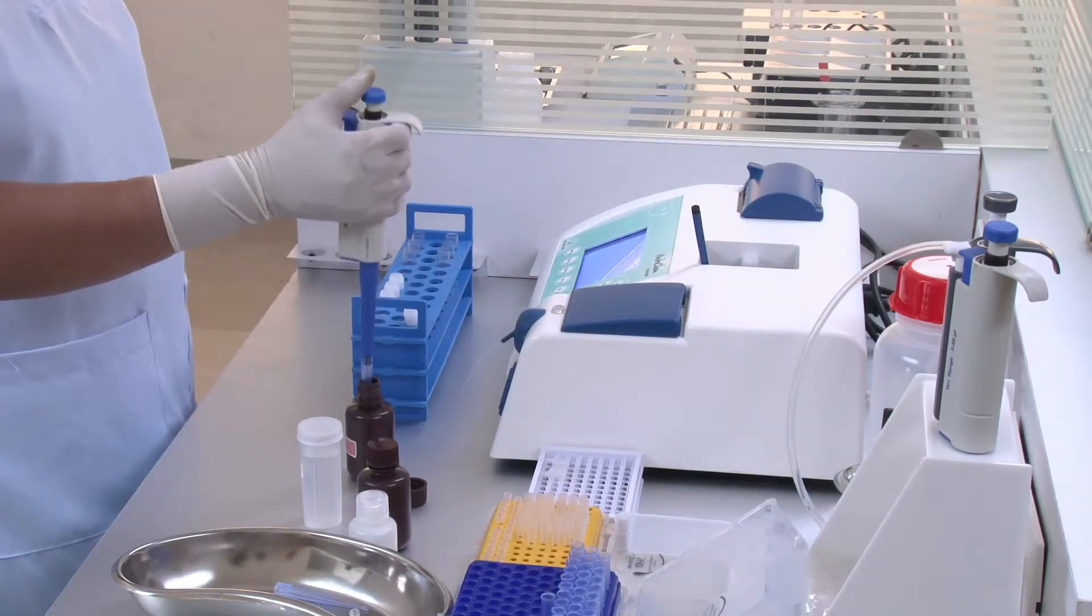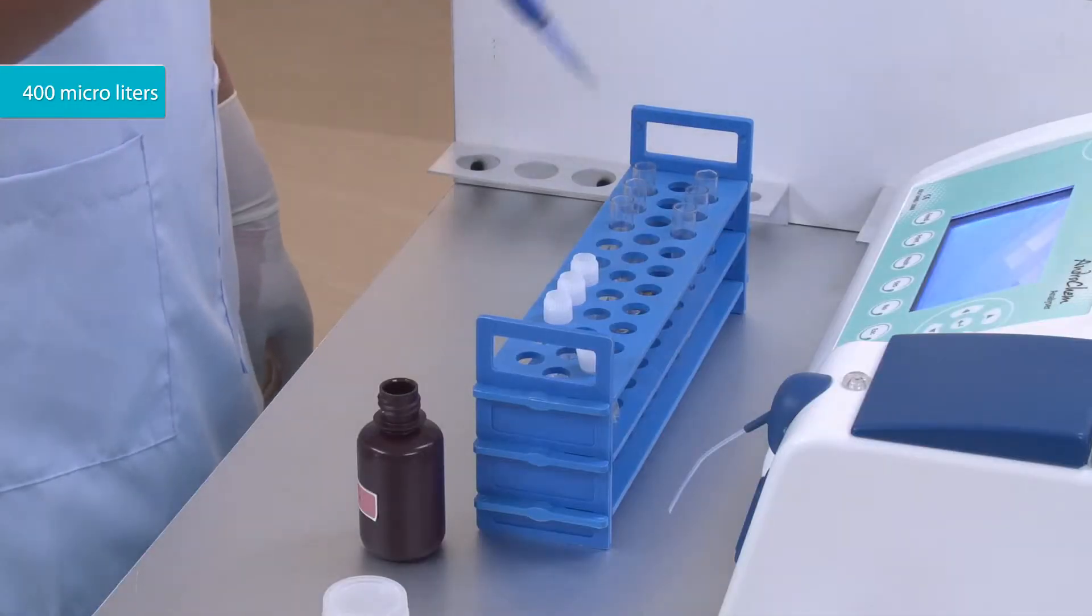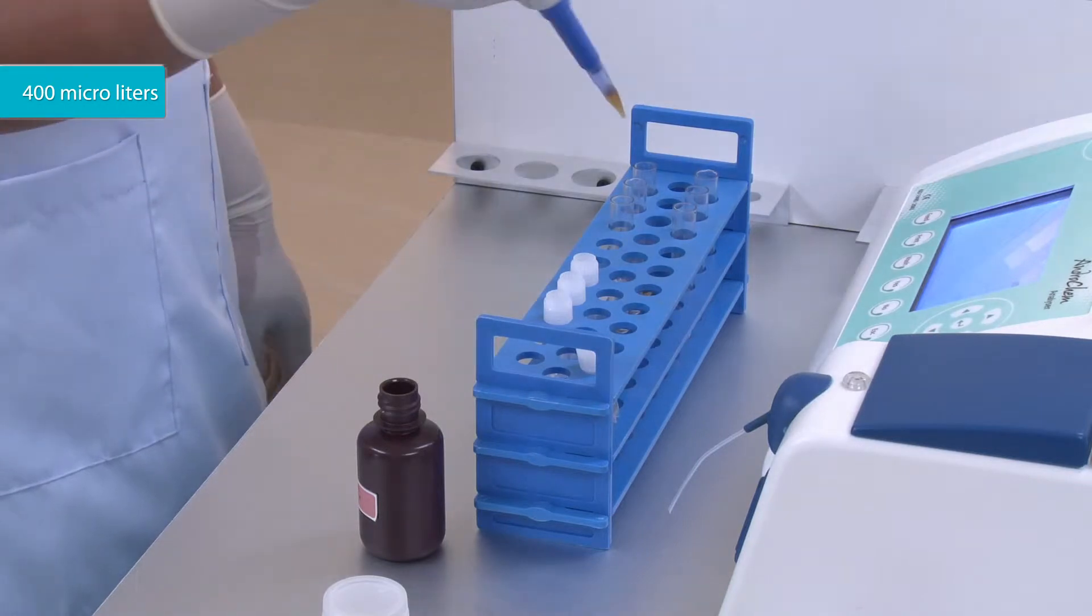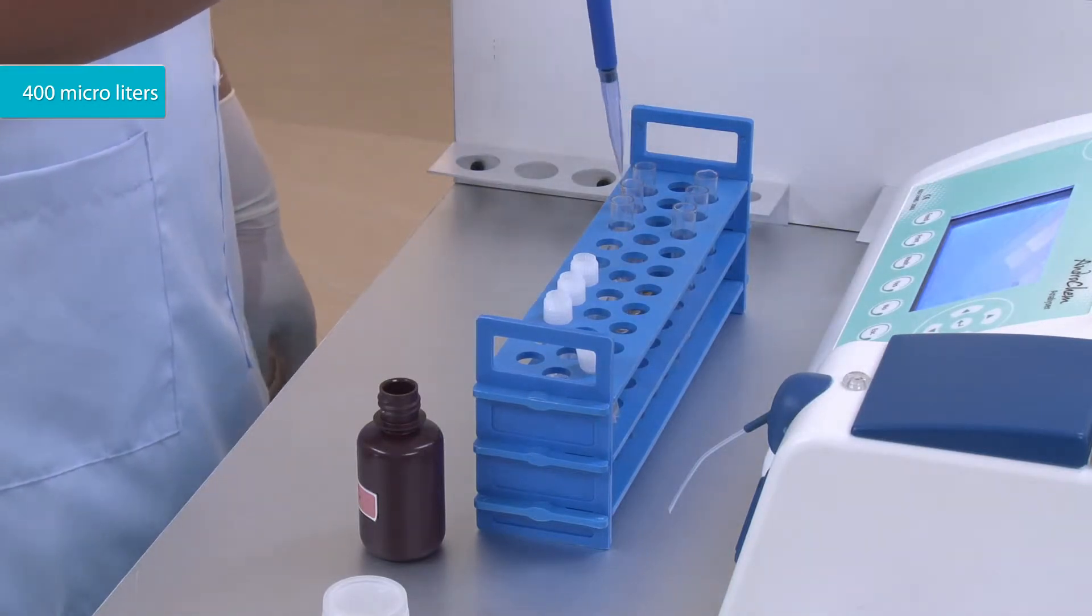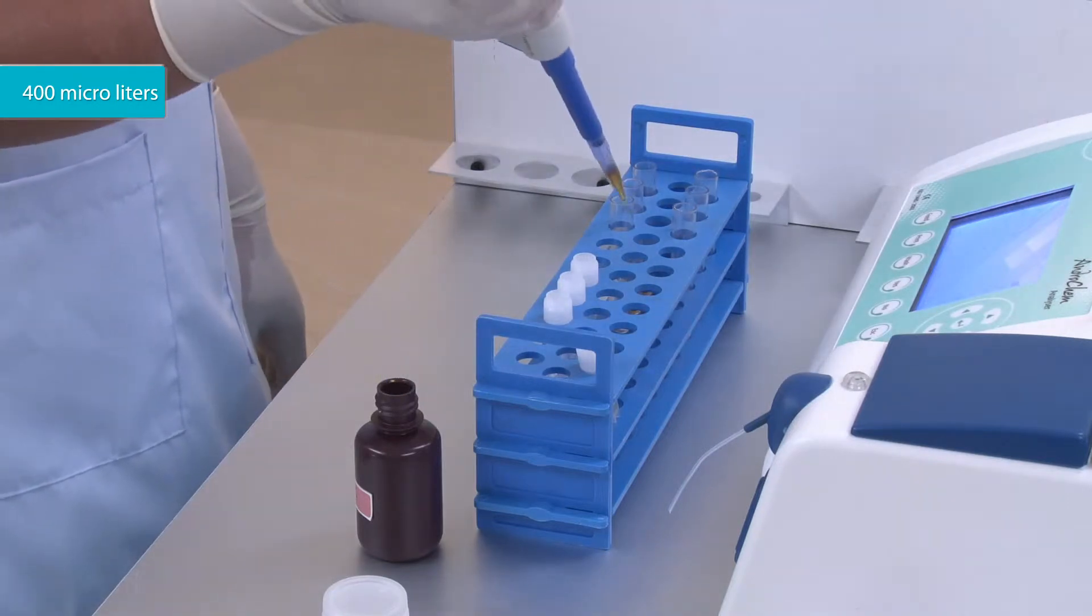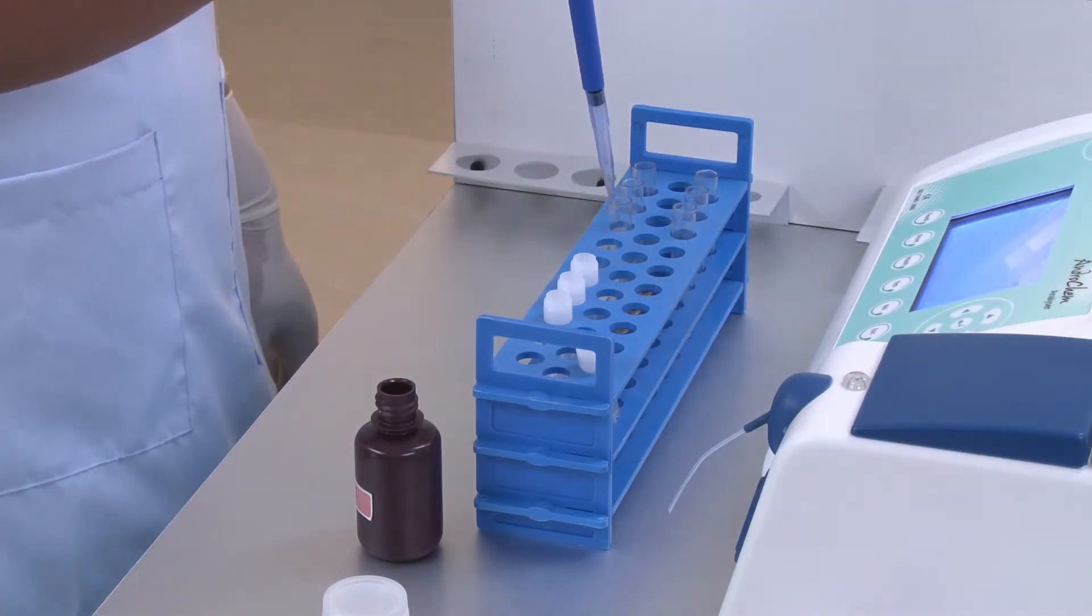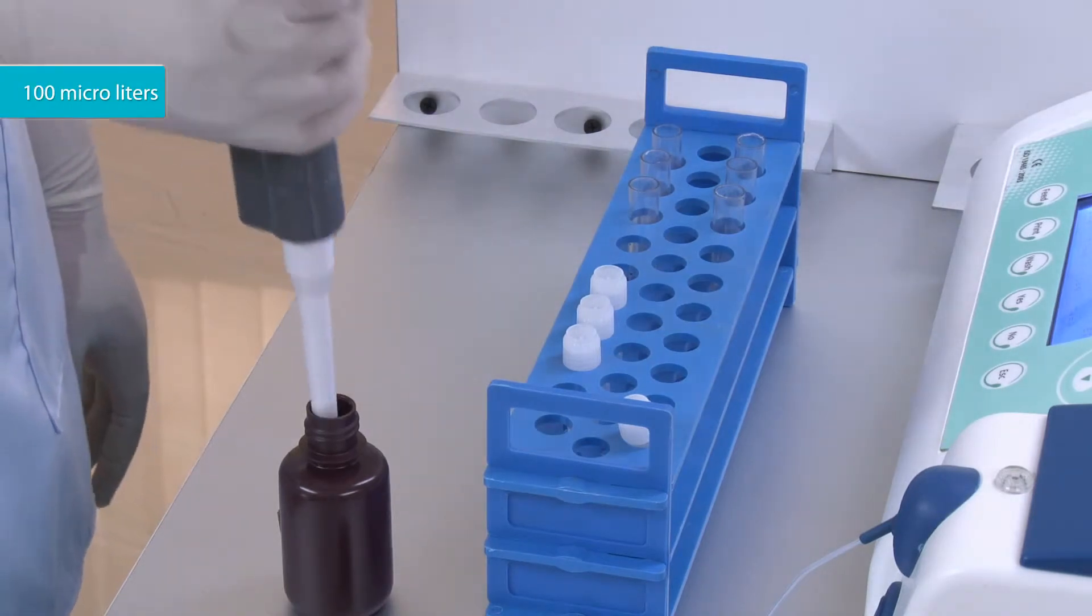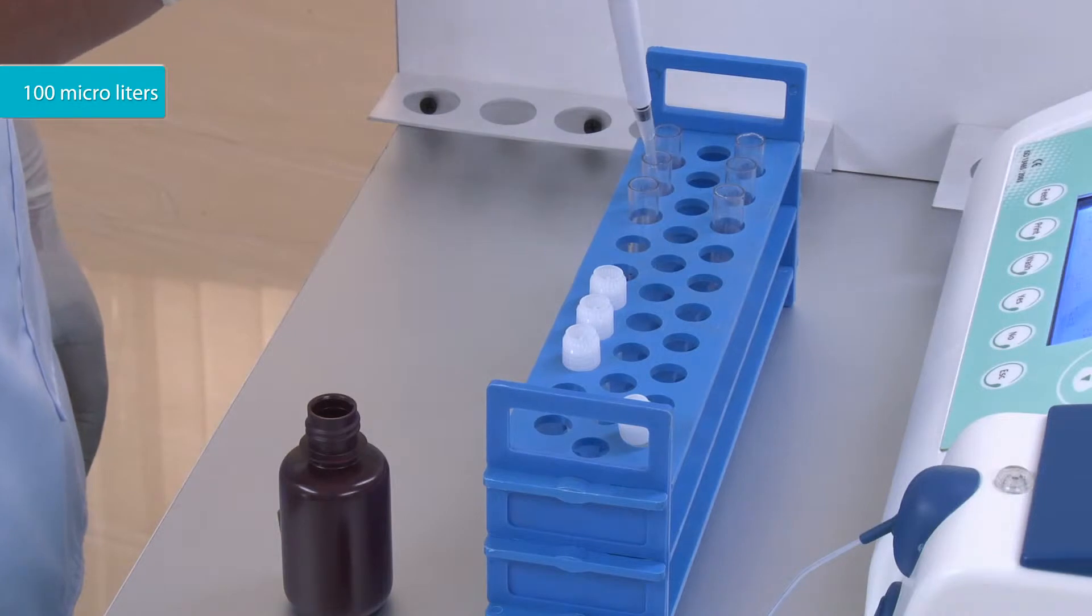Put 400 microliters of reagent 1 to all three tubes. Add 100 microliters of reagent 2 to all three tubes.